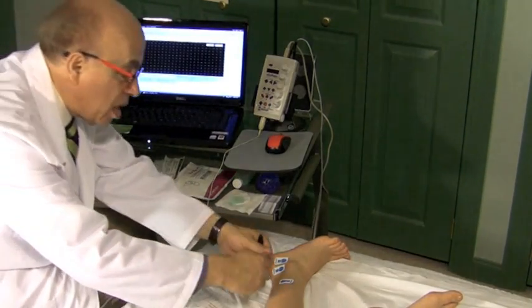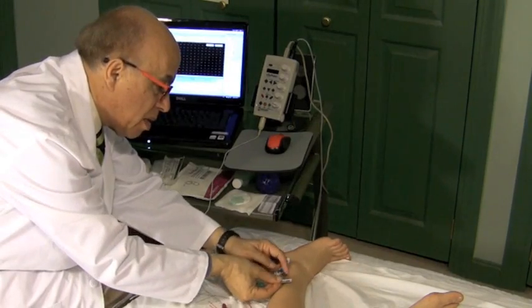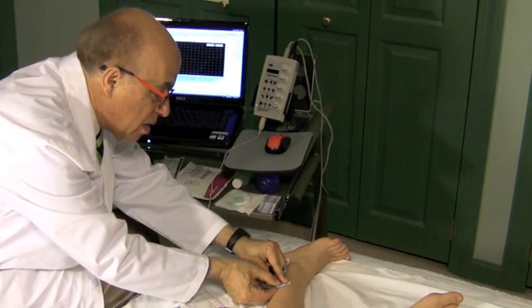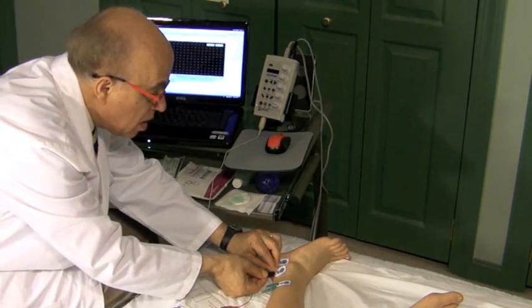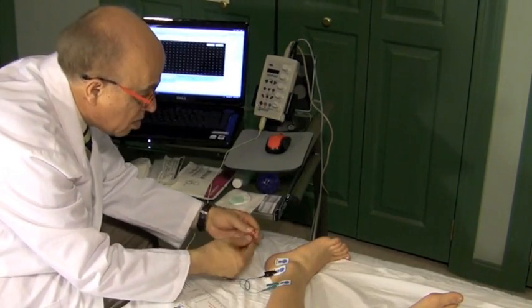Let's connect the green — actually, let me reverse that to make it easier. Connect the green. That's the ground. Connect the black — that's the active electrode. And then connect the red — that's the reference electrode.